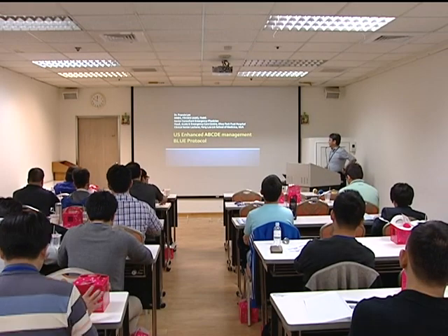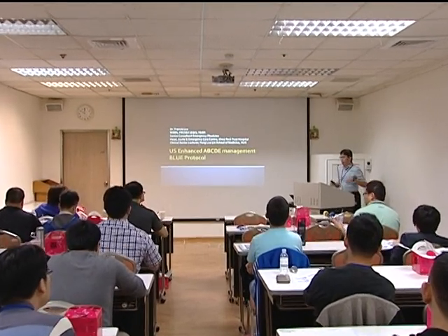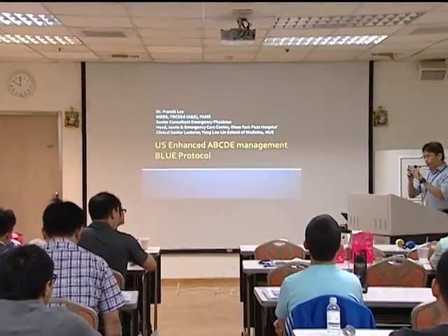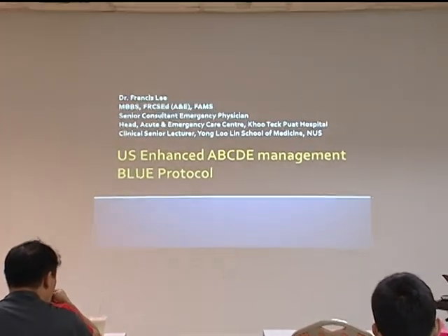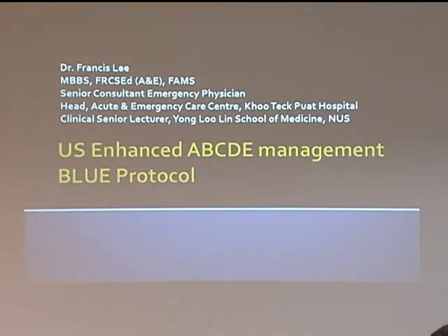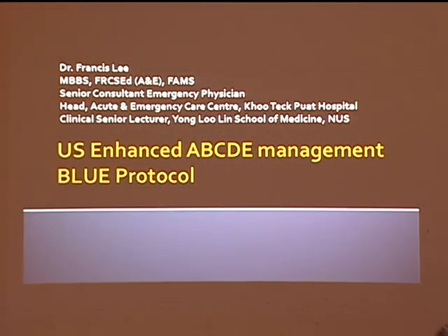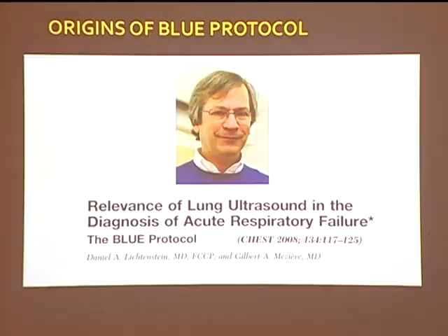After one day in the morning of lectures, learning all the basic skills, it's time to put all the skills together into a system of examination. The first one I'll talk about is blue protocol. The word blue comes from the fact that the patient is dyspneic, and therefore they are blue in color. I was thinking whether blue stands for something, but actually it did not.